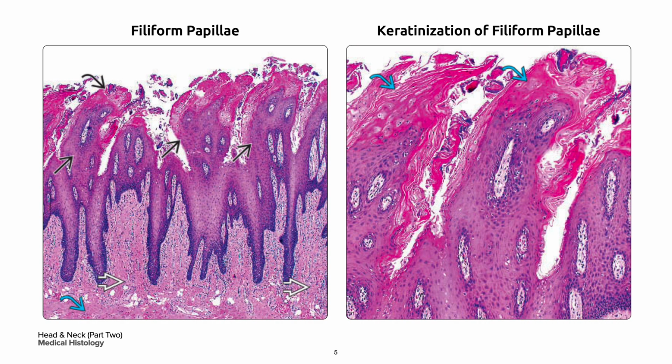On your left is the dorsal tongue surface, which is carpeted with conical-shaped filiform papilla, around 2 to 3 millimeters long, in a single black arrow. In contrast to other papilla, the filiform papilla are heavily keratinized, that is, in curved black arrow, especially on the tips.